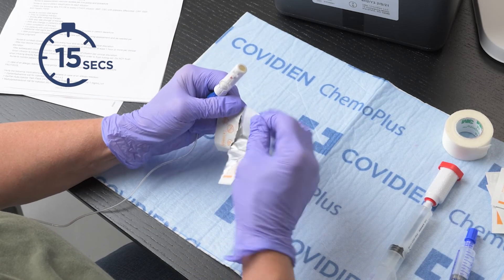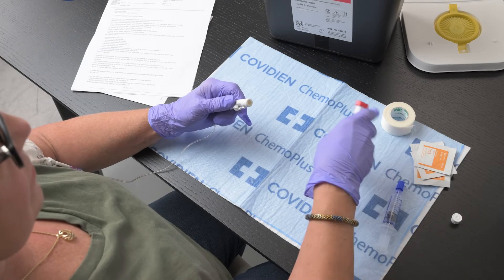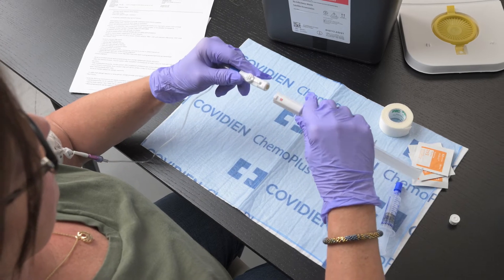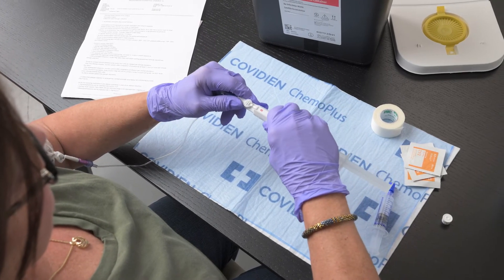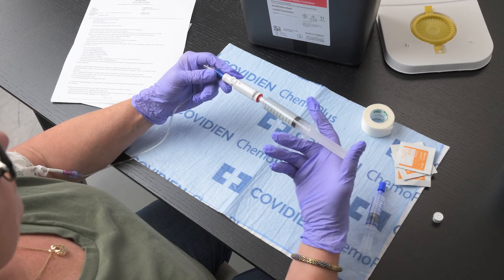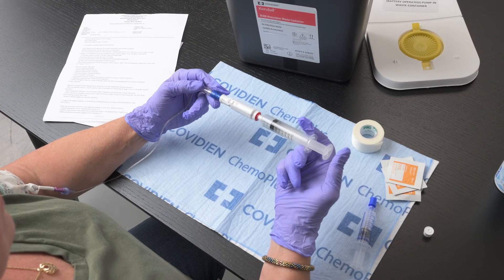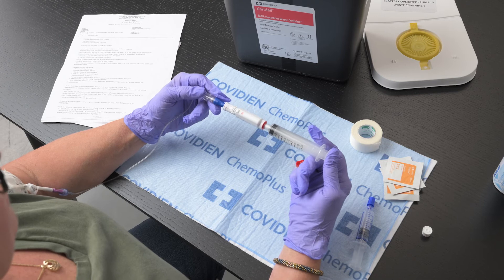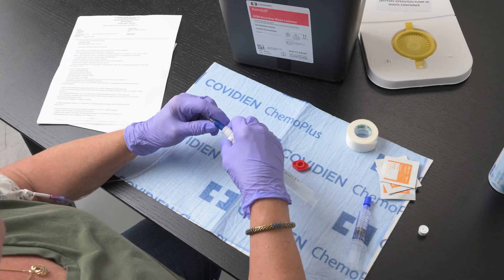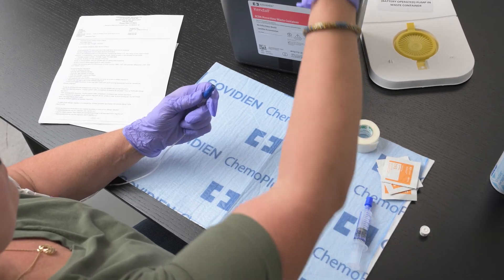Scrub the hub of the male connector with an alcohol wipe for 15 seconds and let air dry. Remove the red protective cap from the female connector that is connected to the saline flush. Line up the red lines on the connectors and press on the female connector until you hear a small clicking sound. Flush the line with saline using a push-pause method. Disconnect the entire Equishield device with the empty syringe attached from the blue end cap by squeezing the sides of the male connector and twisting. Take care not to remove the blue cap. Place in the hazardous waste container.